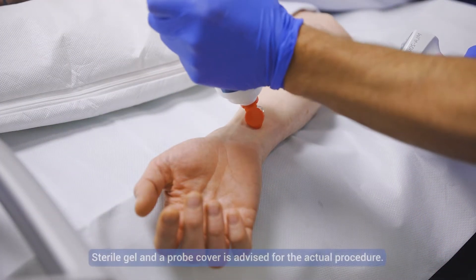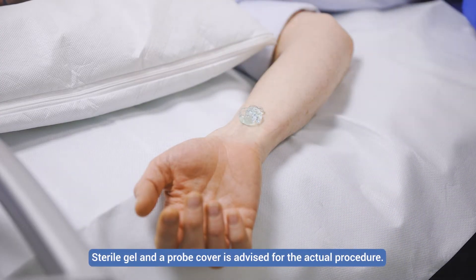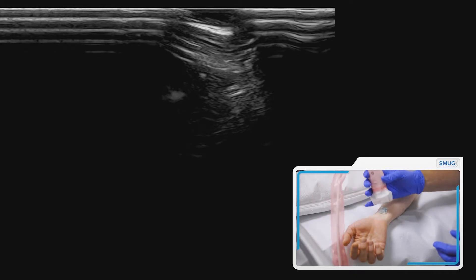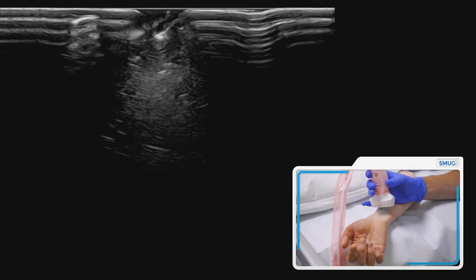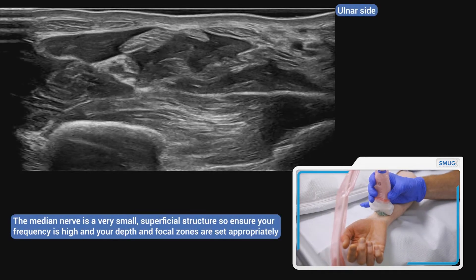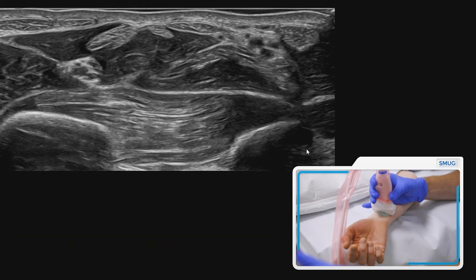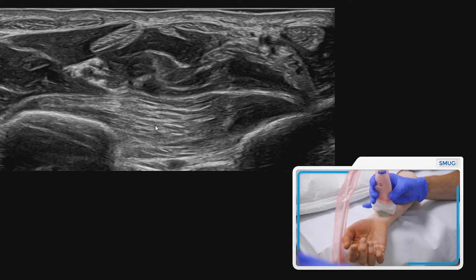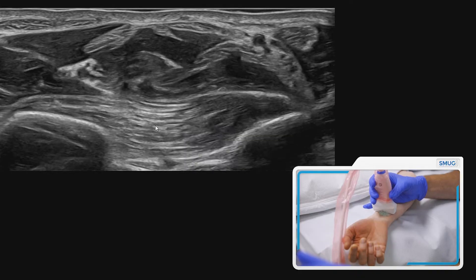Let's go through the anatomy first. If we're doing an injection we would use sterile gel, but on the preliminary scan you can see that the ulnar side is on the right-hand side of the image. The first thing you have to do is be confident with your anatomical position, and importantly you need to identify the median nerve from the surrounding tendons — they can look quite similar, particularly in transverse section.